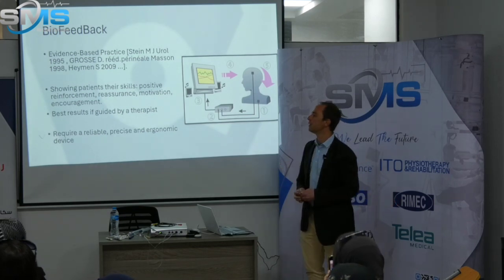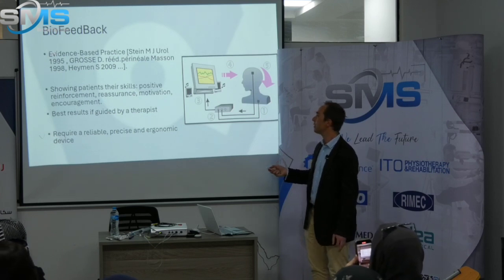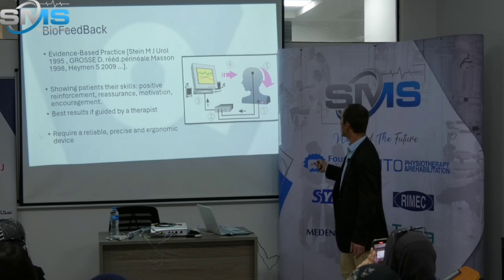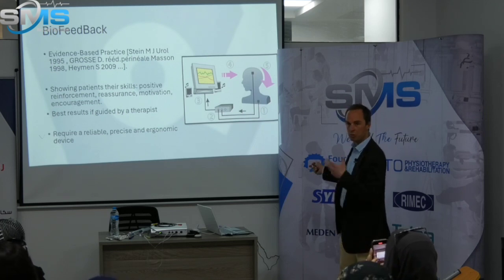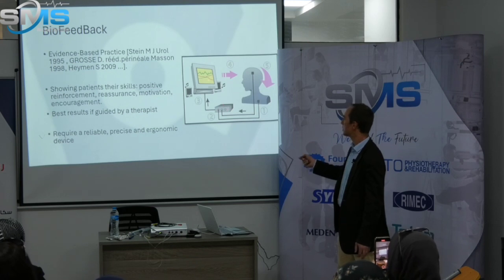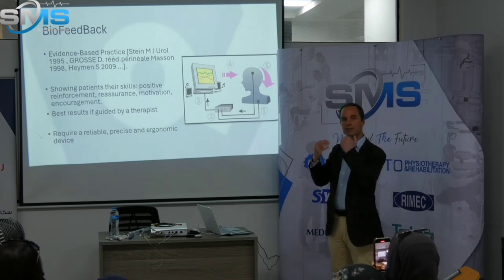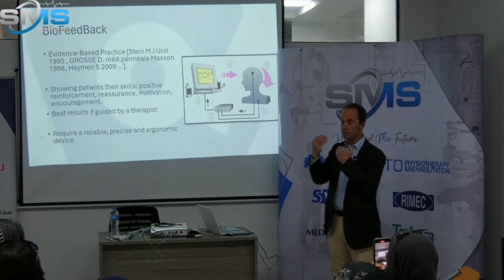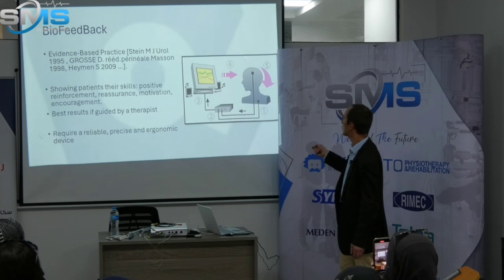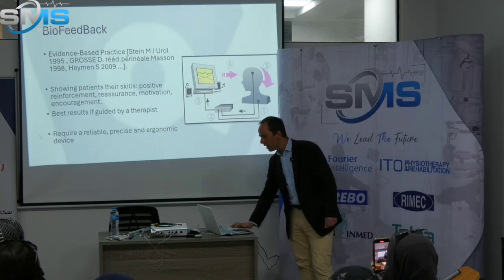The second technique should be the one you use the most because it's the most efficient. It's biofeedback. Biofeedback's principle is here. So your patient tries to contract a muscle here at pelvic floor. The device records this, shows this to a screen, and it's going back to the patient, and he can see if he succeeds, if she succeeds or not. And this turning around makes things work better and better and better.